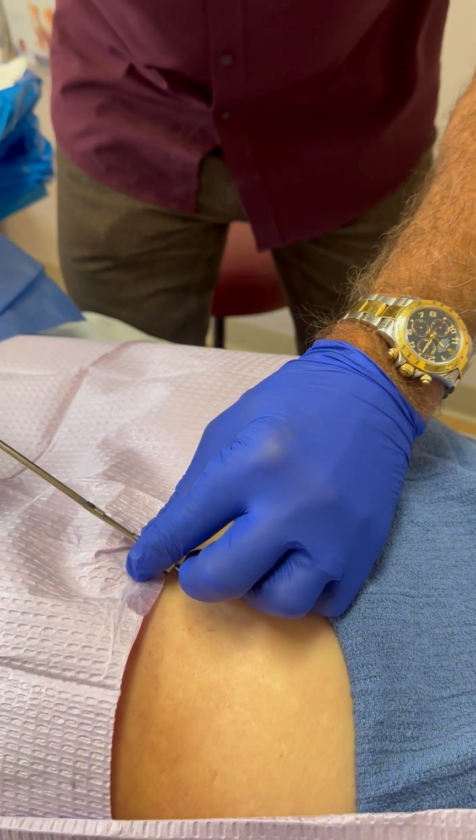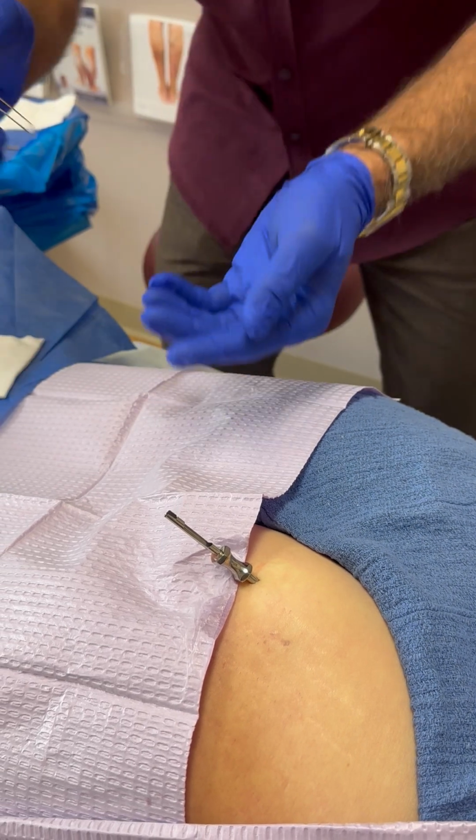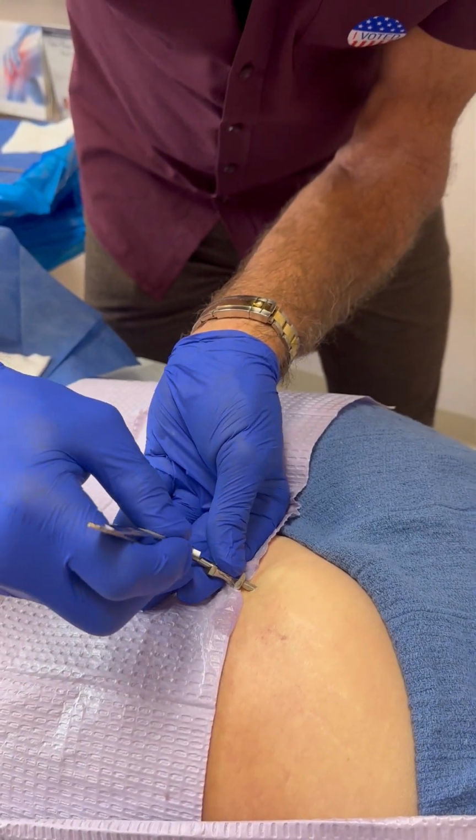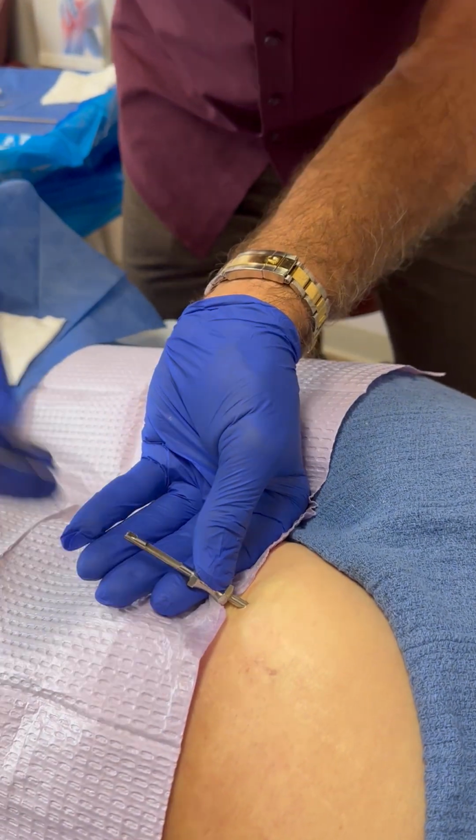I pull this back out. And I have 3 pellets here. One's a 100 milligram testosterone pellet. A woman has about 20 times more testosterone than estrogen when she's premenopausal. Postmenopausal, they both go away.